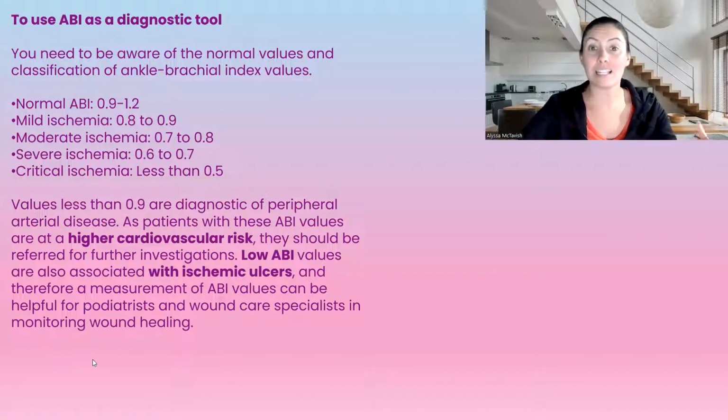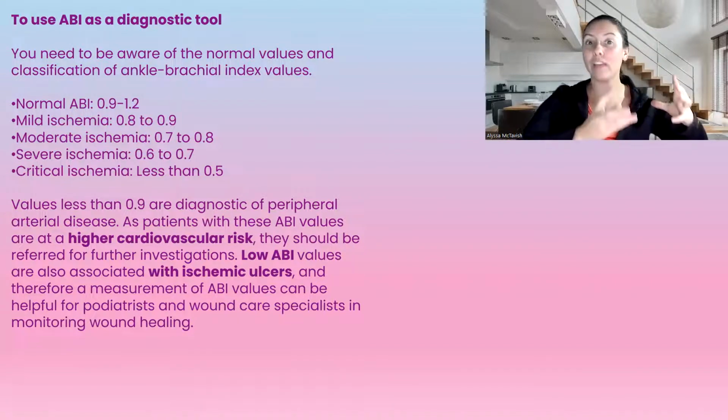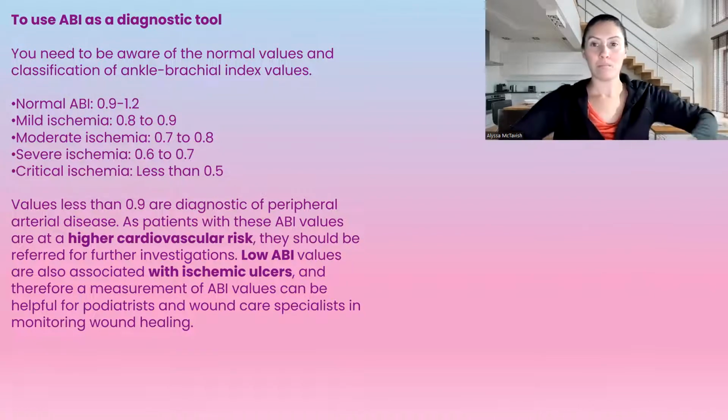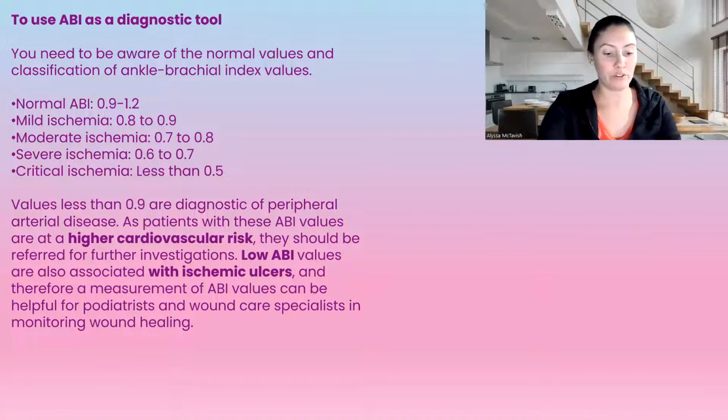It also gives us an idea if we can actually compress a leg. If somebody has an ulcer on their leg and it's a venous leg ulcer, this tool allows us to see if we can safely compress the leg to move that fluid, the edema that's sitting there with venous ulcers, back up the leg, and we can actually get healing out of the wound.